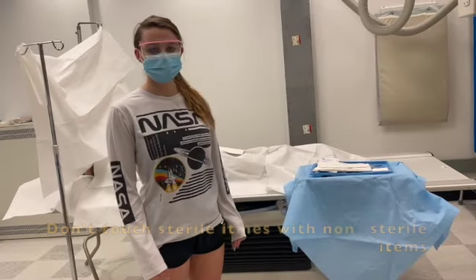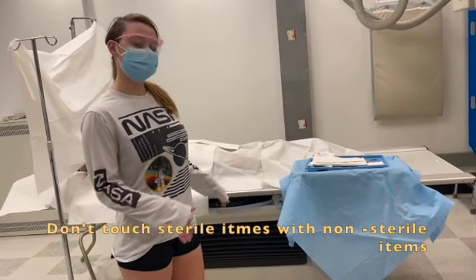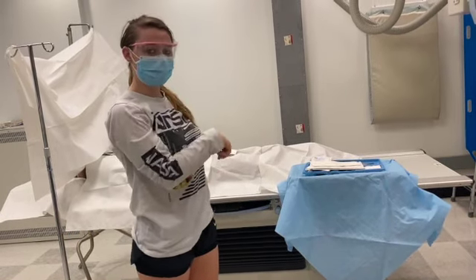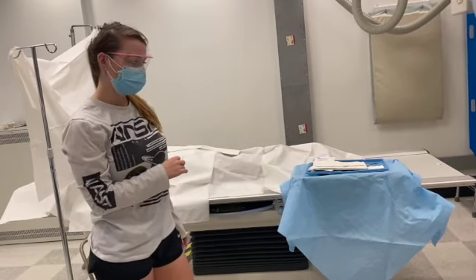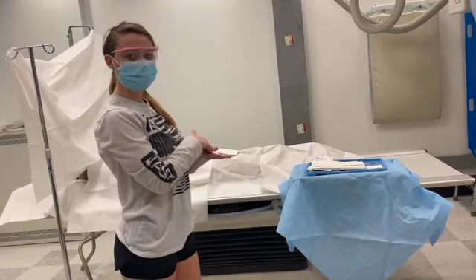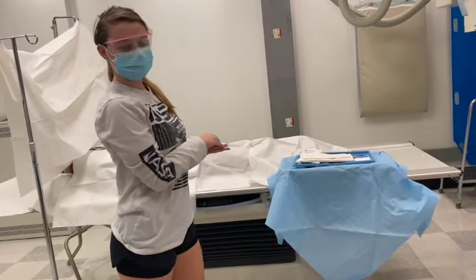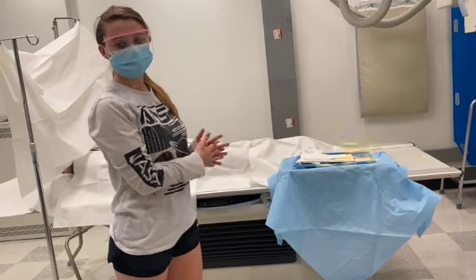When using the C-arm, you have to make sure that you don't bump anything non-sterile when the sterile drape is on top of it because you have to get a whole new bag and that can hold up the whole surgery because they need to see exactly where they're putting all of their hardware and their needle placement, so that can cause a lot of issues within the surgery.